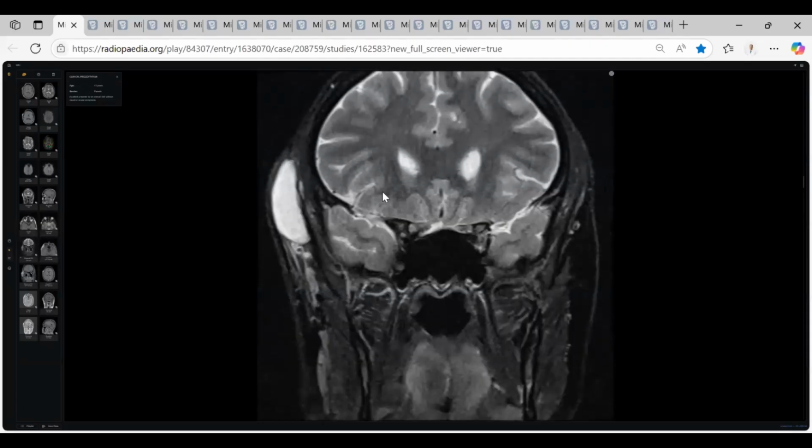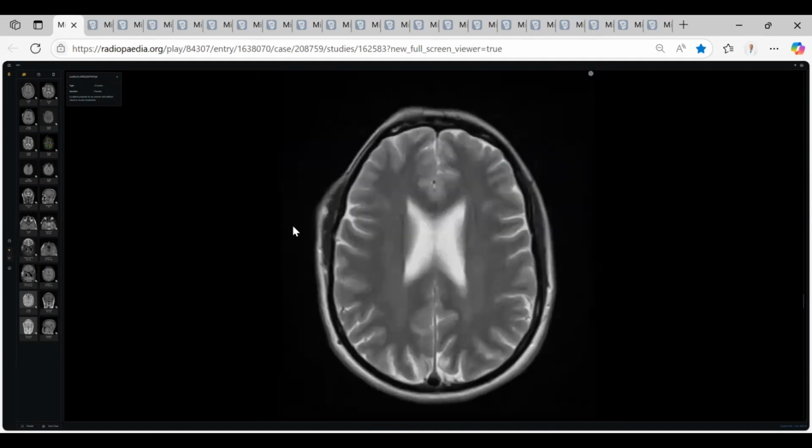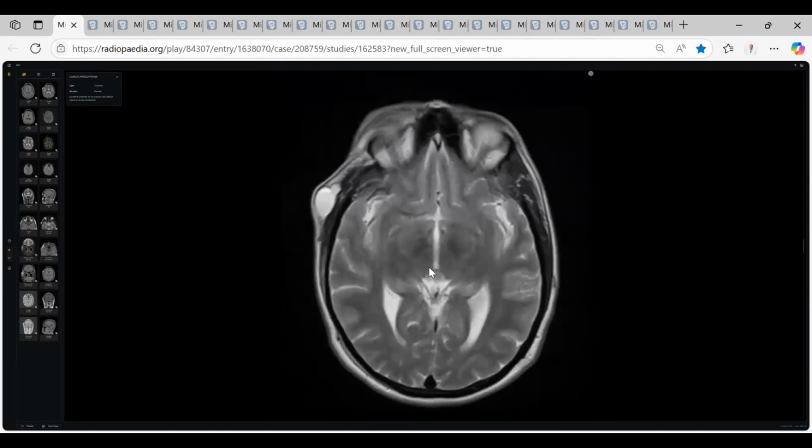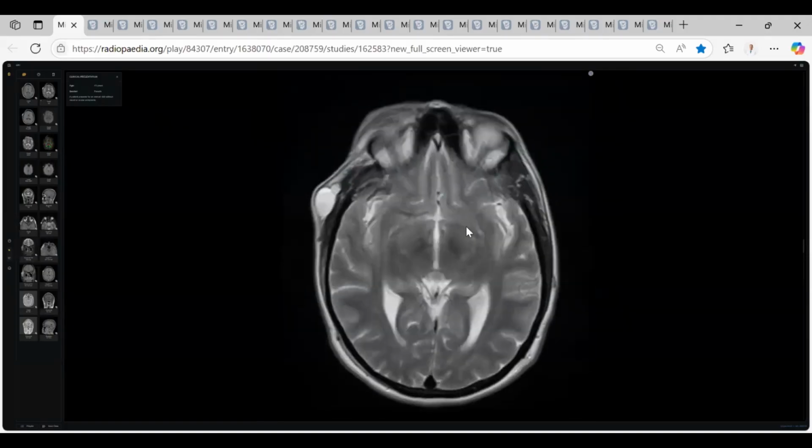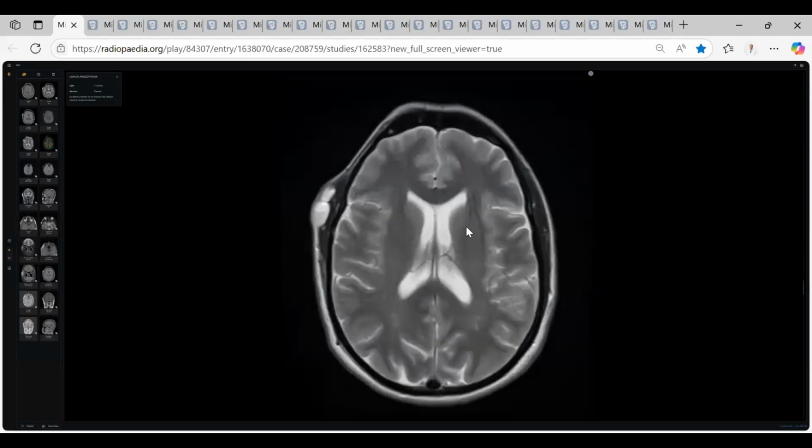And what would you want to exclude from a brain MRI in case of NF1? Sir, optic nerve gliomas, then unidentified bright objects, FASI, sir. And what else? What else would you want to look for? You didn't ask for detail, so he didn't give you.